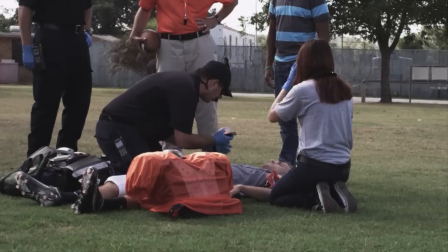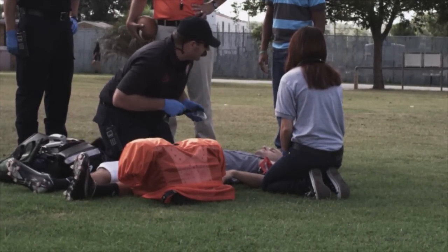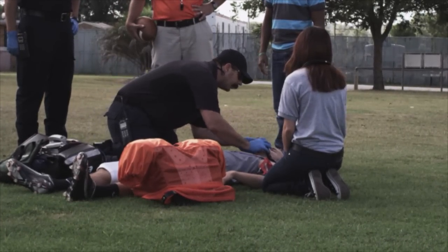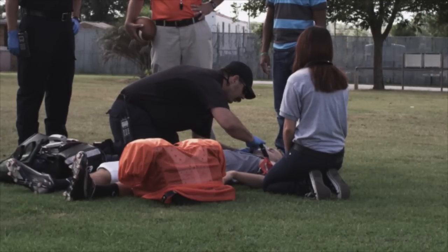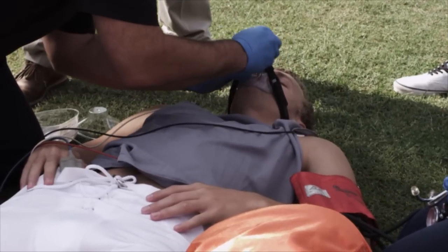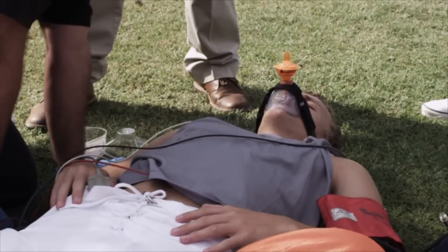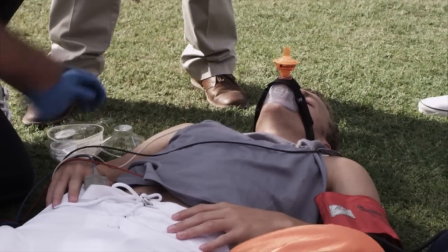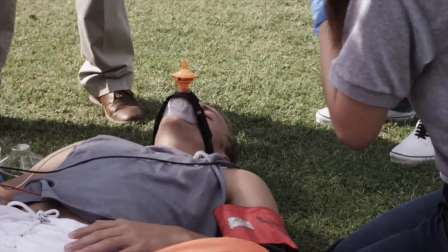All right, buddy. I'm going to put this device on you. It's going to help you feel a lot better. What I'm going to need you to do is breathe nice and slow for me, deep and slow. Nice and easy. Could you reassess the blood pressure for me?